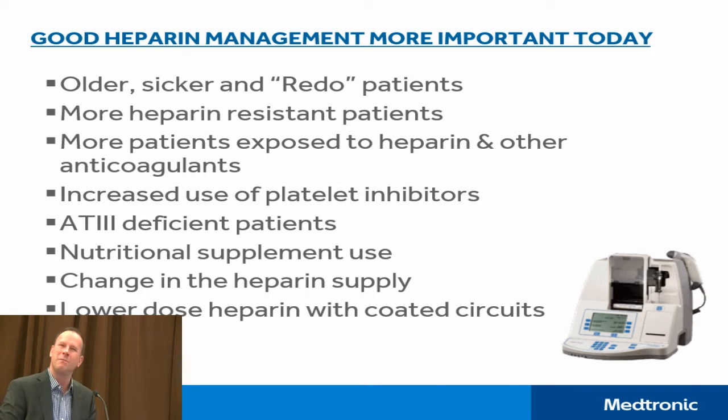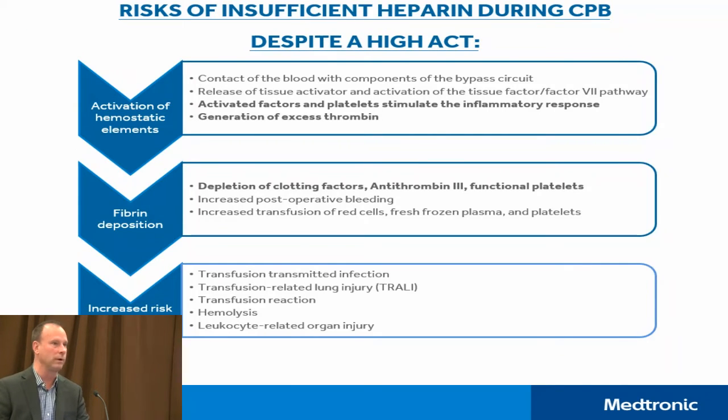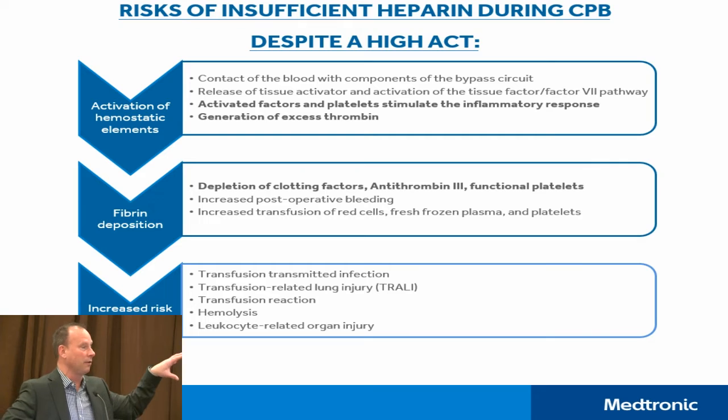for the non-HMS users who aren't as familiar with it and are still more ACT based, and even for current ones, sometimes there's this question of why is this darn thing asking for more heparin, and I have a 600-second ACT? It can feel counterintuitive to give a little bump of heparin when you've got a nice high ACT. It just feels strange. Well, there are some clinical reasons why that extra bit of heparin helps preserve the clotting factors of the patient. And these are the three categories of what can happen if you've got a higher ACT level, but you're actually running at a low heparin level, and you're subtherapeutic. And if you're subtherapeutic, it doesn't necessarily mean you're going to get this giant clot in your pump. You're not in a crash situation.